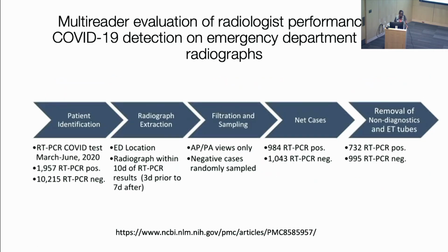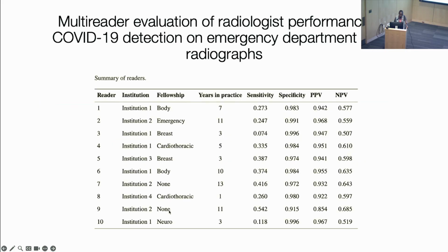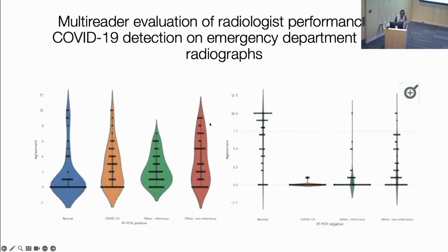I mentioned that you can do radiology reader studies. They're expensive, so be very smart about how you do this. Harry did this for us during COVID. We had 10 radiologists. You have to capture what they read. If you are trying to look at performance in the emergency room versus chest-trained radiologists who only read that modality, obviously there can be performance differences. These are some of the metadata you have to look at, and this shows a big spread, right?